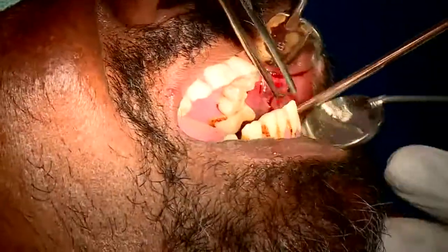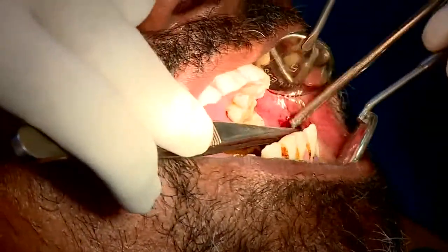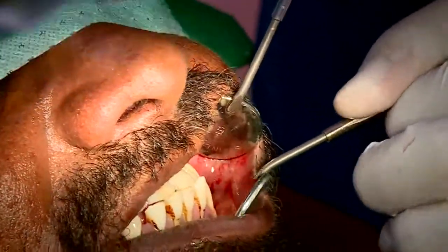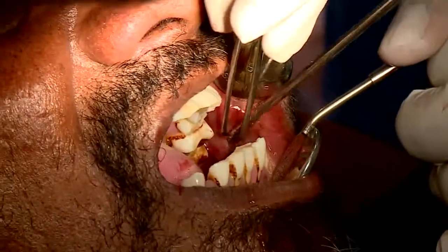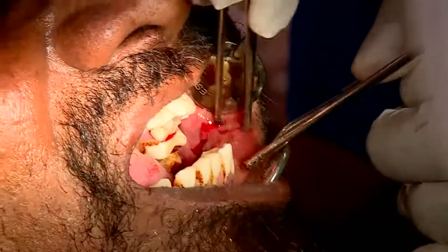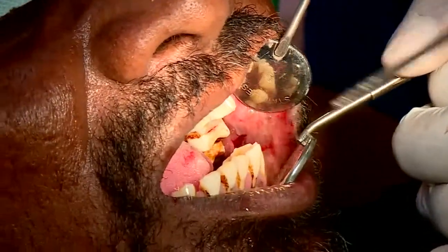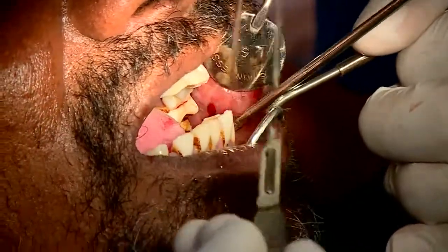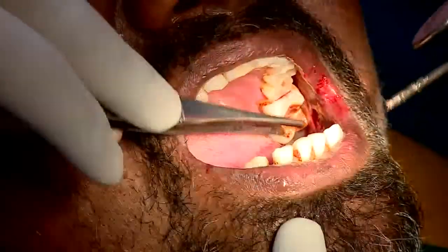For this patient, the biopsy procedure might be slightly tough because of the limited mouth opening of the patient. So it's challenging for the surgeon, but he is managing. Okay. Patient is feeling mild pain. Very good.